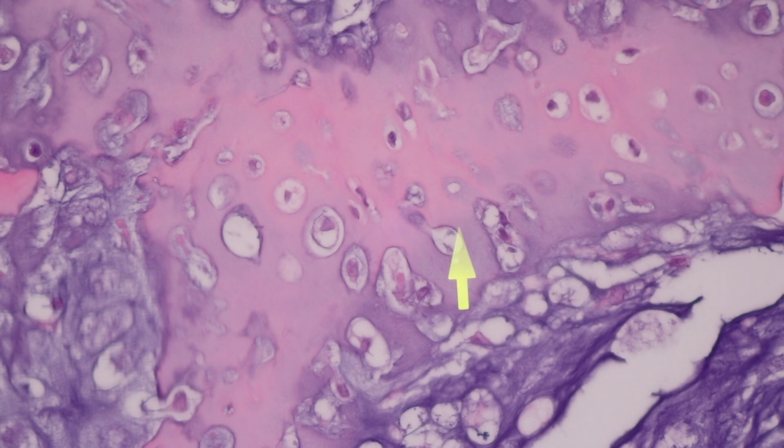So remember what hematoxylin and eosin is doing. They're acids and bases, and they're binding materials based on whether it's an acid or base. So if the glycosaminoglycans' composition is different, so their acid-base character is a little different than normal cartilage, it may be staining with more eosin. So biochemistry comes in handy.